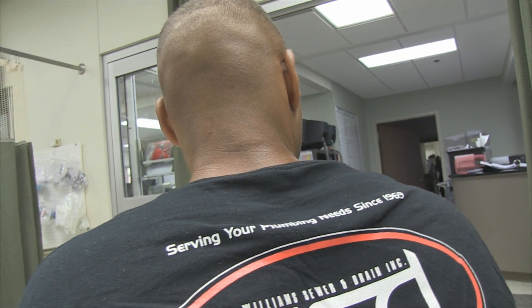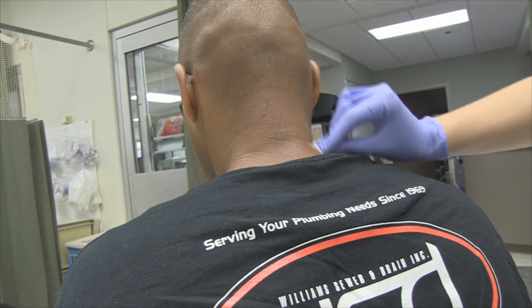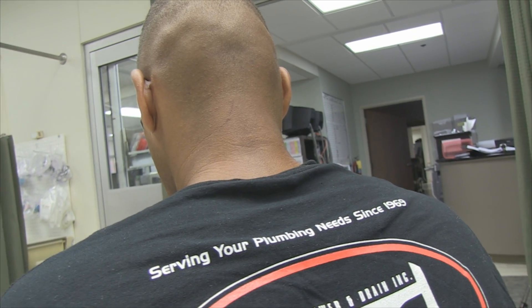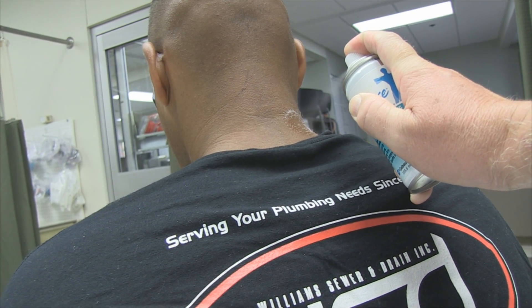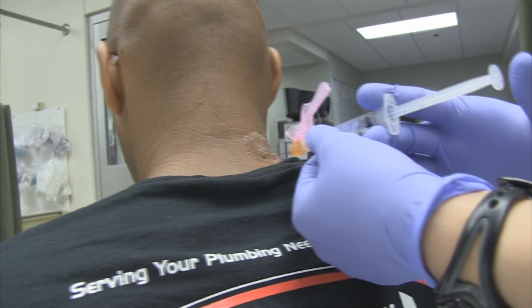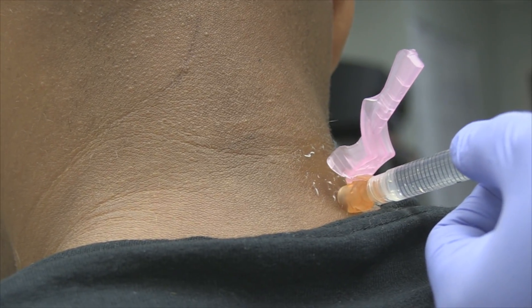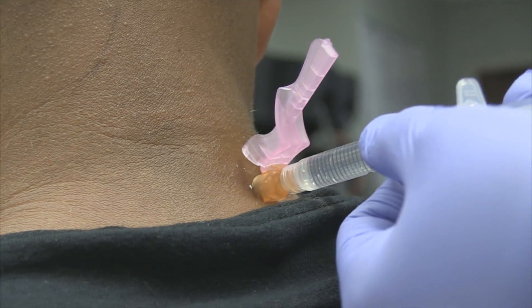Your job is to look straight ahead and keep your head up just like that. I'm going to spray some cold stuff — some vapocoolant — on your neck here.